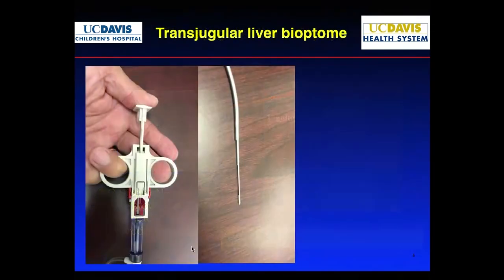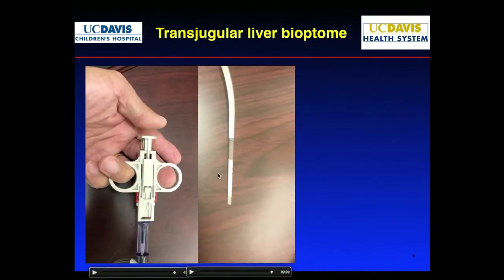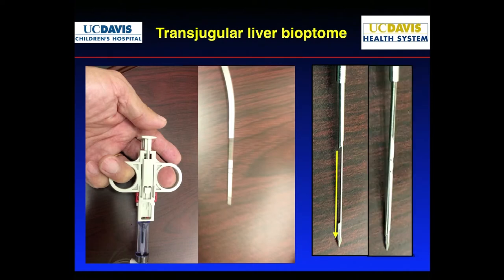It goes through a 7 French system. So this is what it looks like. As you push this, the throw jumps over the needle and captures that core of tissue. Let's see if I can show you that. So this is the throw here. Here's the needle, and inside the needle is a hollow core where the tissue is obtained when the throw jumps over the needle. So that's how it works.